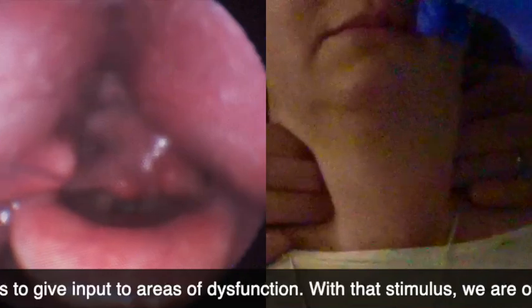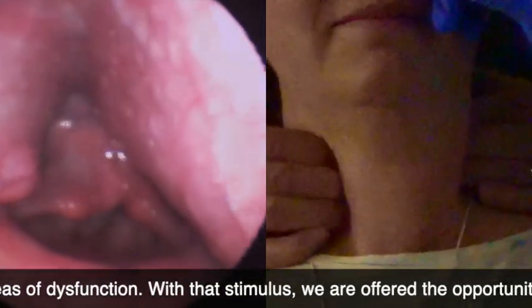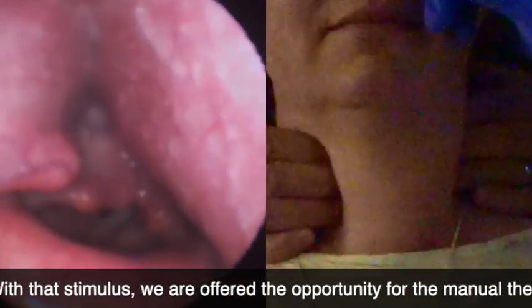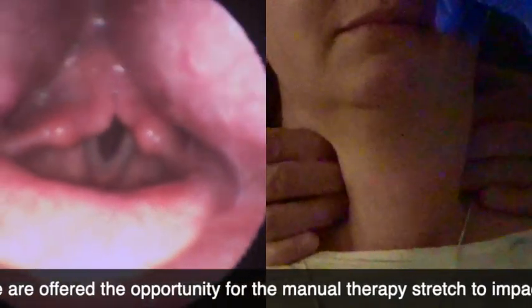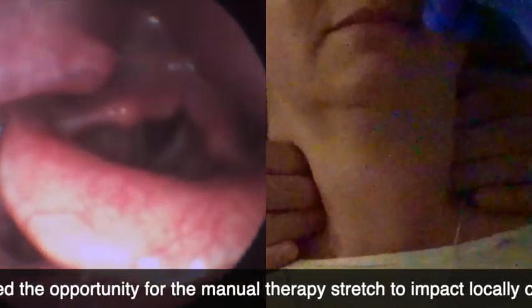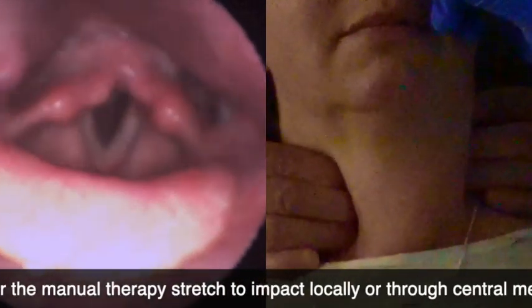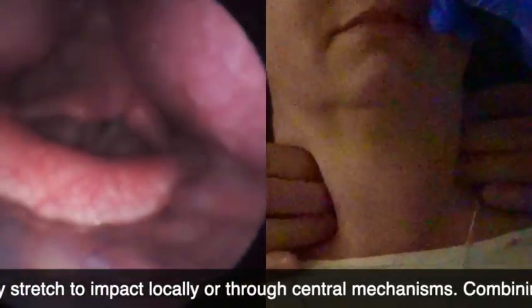It's a mangled mess in there, huh? Yeah, but lots of asymmetry. But lots of asymmetry may not correlate to lots of dysfunction, right? How about right up in here? Is that your finger on the right? Upper left side? No. That's the hyoid. My right. Yeah, right there. It looks like my finger, but it better not be.